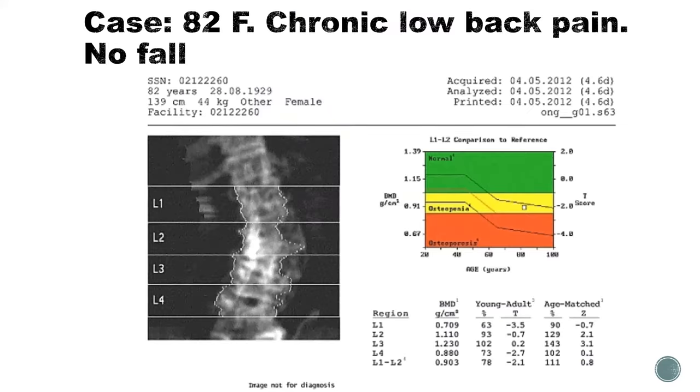What about this one? So there's no poll for this one. Just in your head, what's wrong with it? It's definitely wrong. And look at the T-score here. Okay, so there's some very low T-scores, there's some seemingly normal T-scores, and this looks abnormal.